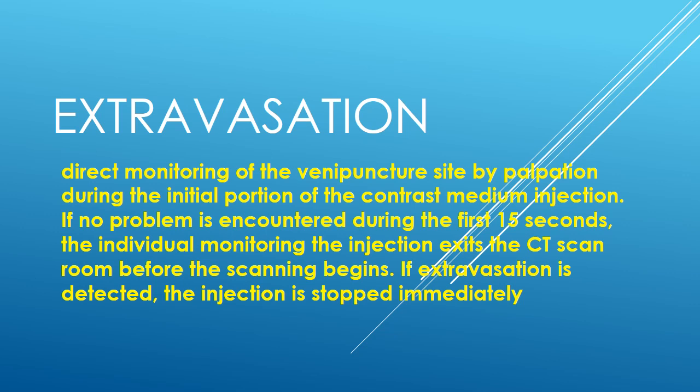The most problematic event of extravasation is whenever you are giving contrast by a pressure injector. Now, in a hand injection, if you are giving a bolus of IV contrast and you see extravasation, what you do is generally stop and then try to give the contrast at some other site. But with a pressure injector, usually what happens is you start the pressure injector remotely, and if extravasation has occurred, you are unable to stop it in time.